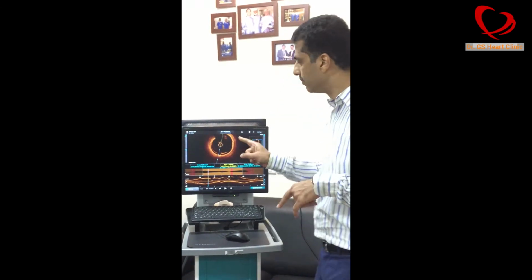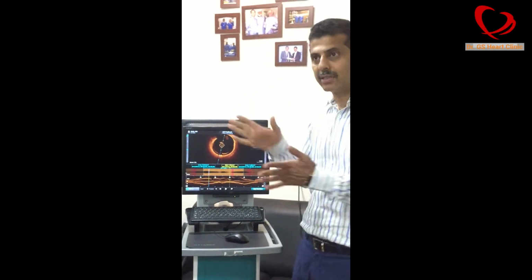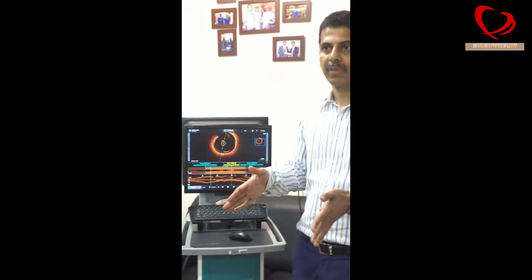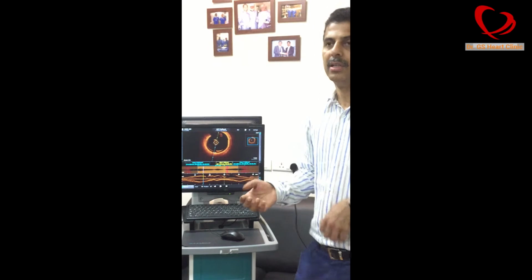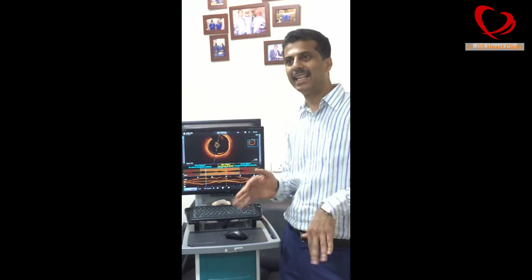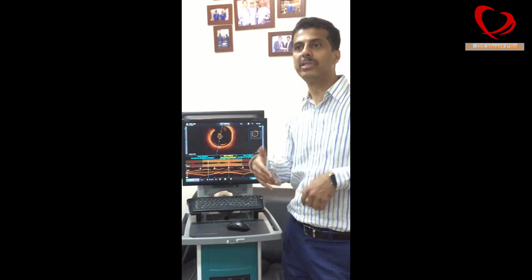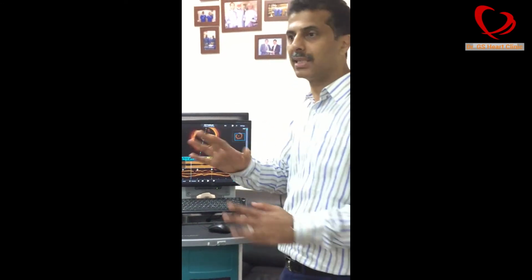Okay. So for him, we also wanted to prove whether the flow is less because of the block. Block is there, we know. But whether the blood flow is less or not. For that, we have to have functional testing, which is FFR. So FFR, normally if you have flow which is above 80%, we don't have to do anything. If the flow is less than 80%, we need to treat. And the lower the flow, the more significant it is.